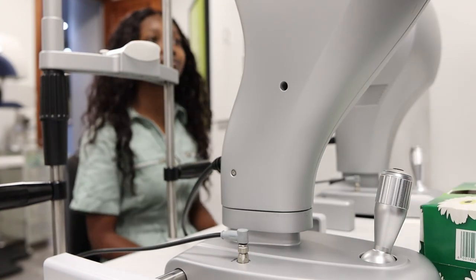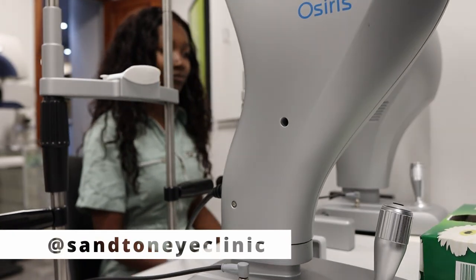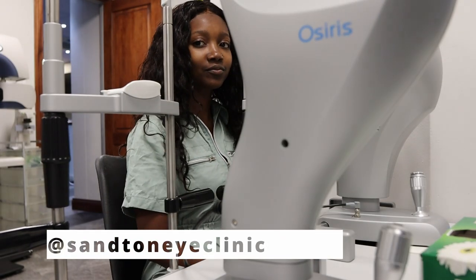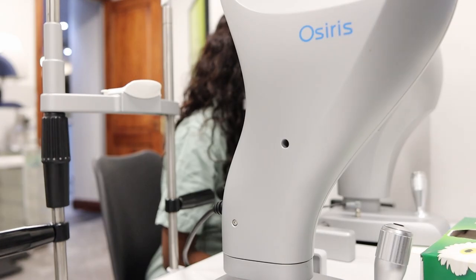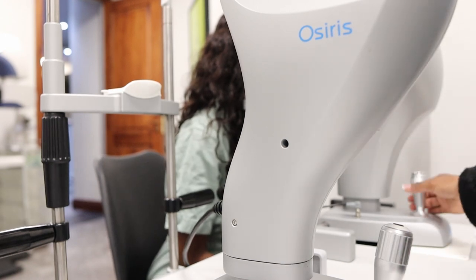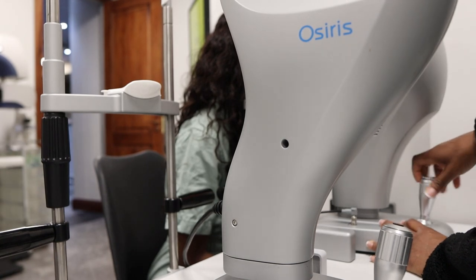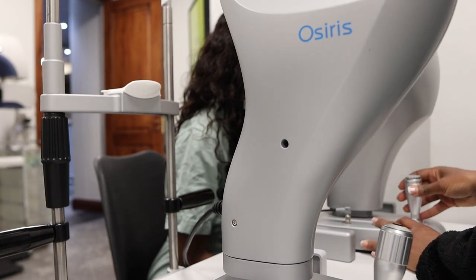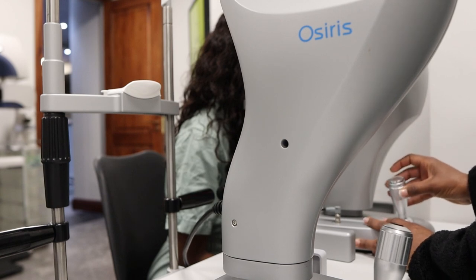Okay, on this one, I'm going to scan your corneas to get your corneal thickness. Sure. You can please place your chin on the chin rest and make sure your forehead is touching the top. Are you comfortable like that? Mm-hmm. All right. I'm going to start on your right eye. Please keep both eyes open. Please blink and then open as wide as possible. Please hold it there. Wide open, wide open.